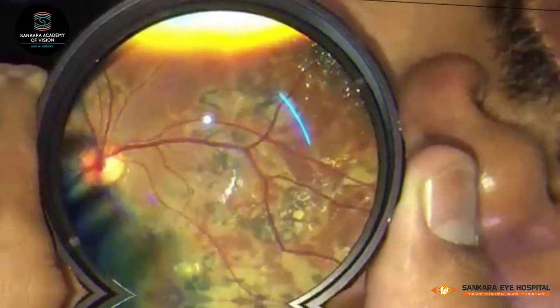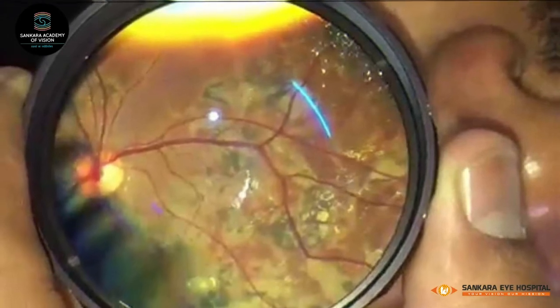The technique is called indirect because the fundus is seen through a condensing lens.